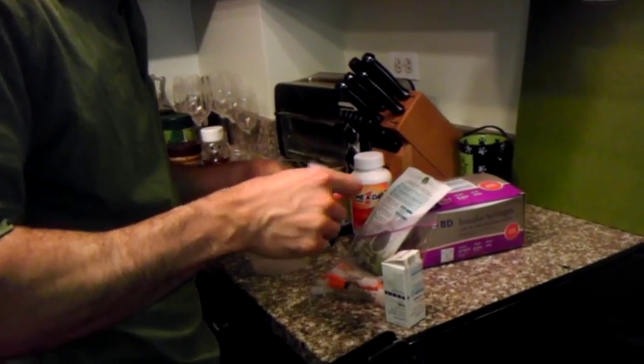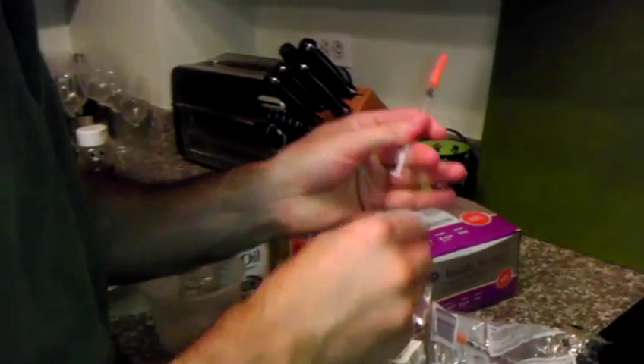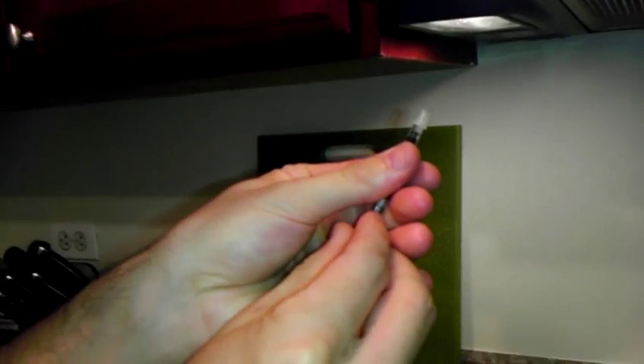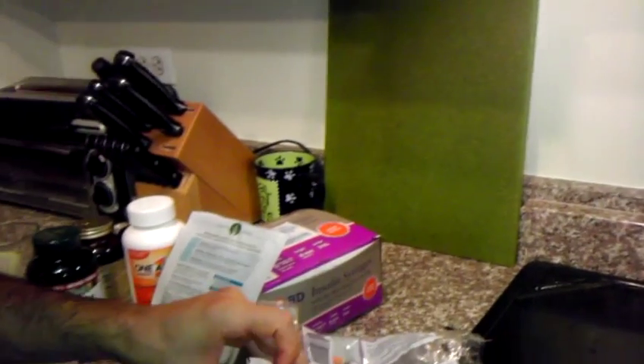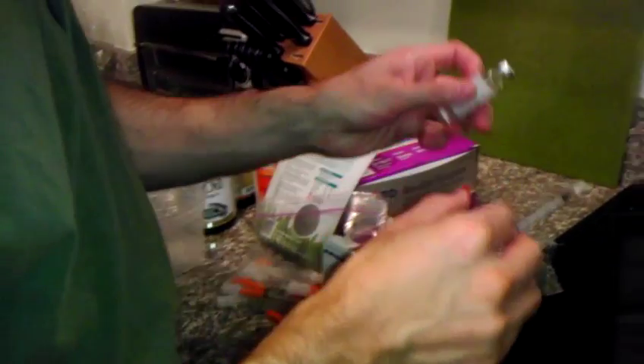So this part is obviously routine. I'm just going to fill up two units on this syringe if you haven't seen it before. The two units on the right side. The insulin.